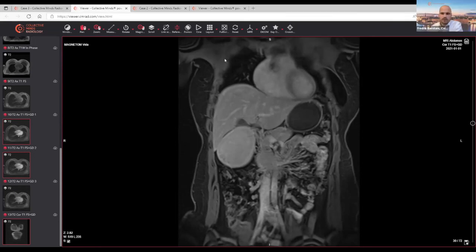We had a final question regarding the biopsy. So how do you biopsy the right part? Is it MR guided or is it ultrasound? We do it ultrasound guided, yes. Not MR guided. It takes too much time from the MR suite. And do you use fused ultrasound with MRI? Myra does the biopsies.